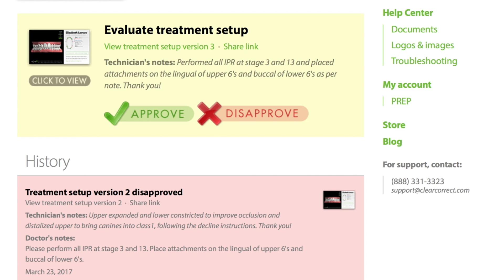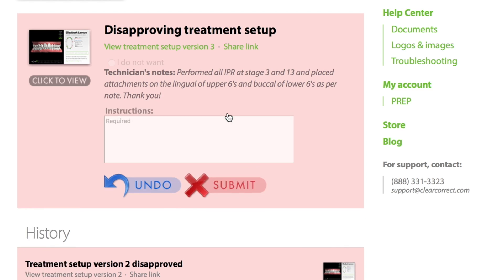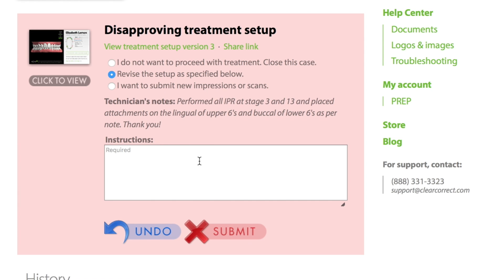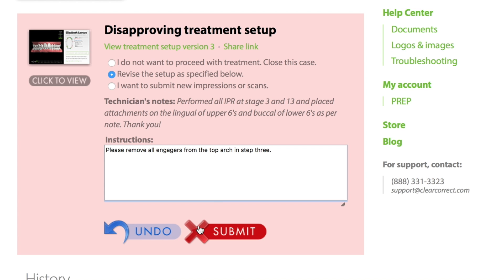If the model looks inaccurate, you want to move the teeth differently, or you want to cancel the case, click Disapprove and let us know what you want to do. Our technicians will do their best to make any changes you request and upload a new version for your approval within a few days.